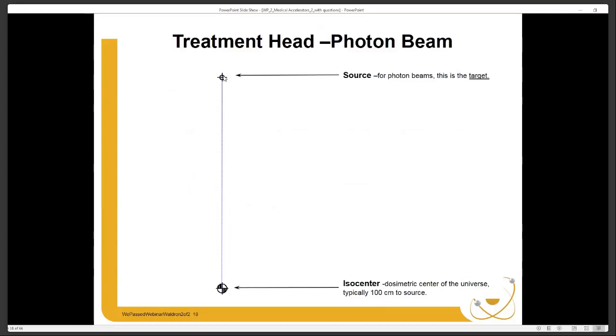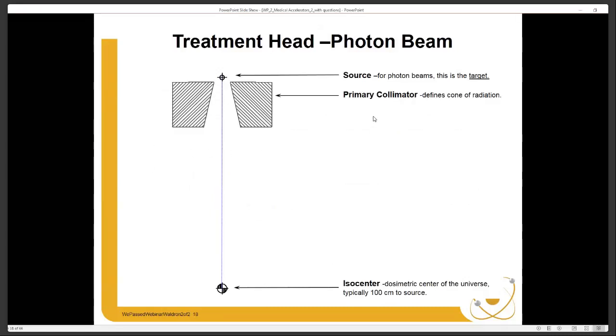And we would like to think that that corresponds to some certain centers of rotation of different parts of the machine, but that is a different lecture. The next thing that the photon beam might encounter is something called the primary collimator. We always draw pictures with rays of photons leaving the target in one direction, but the reality is we are producing a very forward-peaked photon beam, but there are photons and electrons and particles just shooting everywhere in this picture.